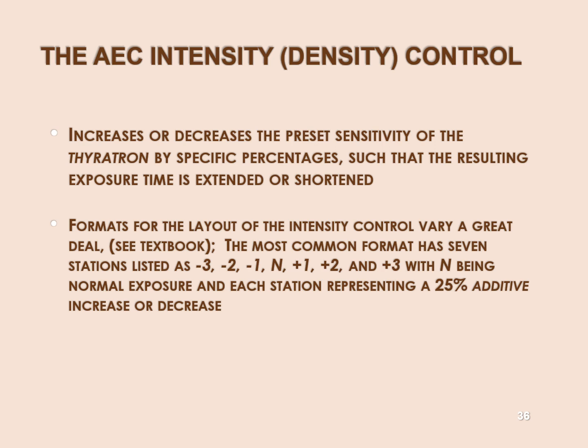Basically, the raw data, the photon intensities that you record on the CR plate or on the DR array, go to the computer, which looks at the numbers in the matrix and says, all these intensities are 3 times too high from what I'm expecting.